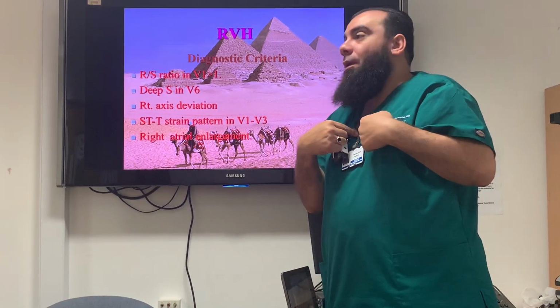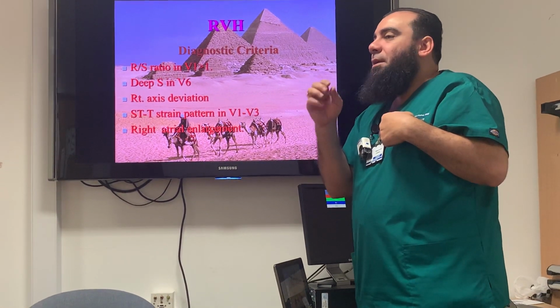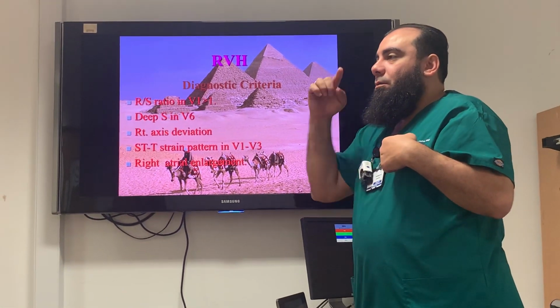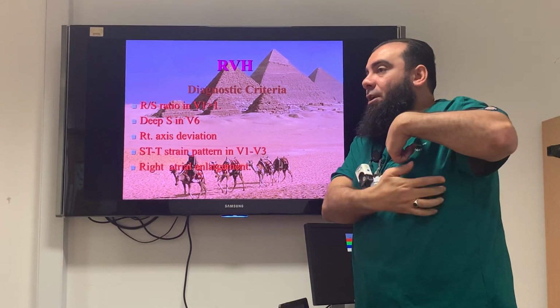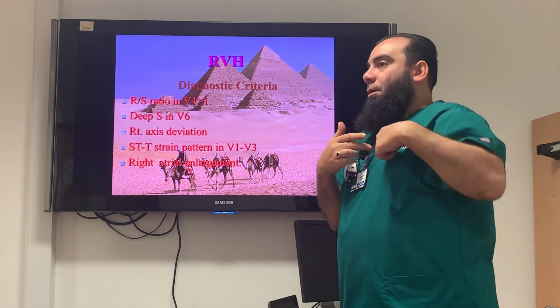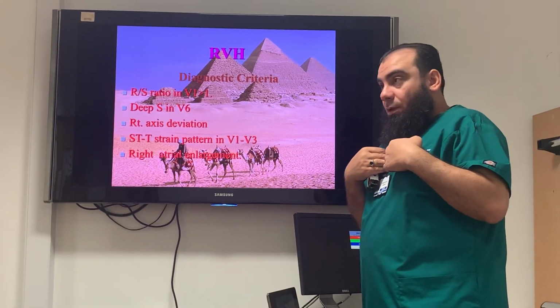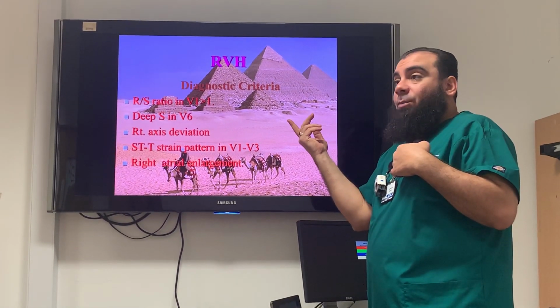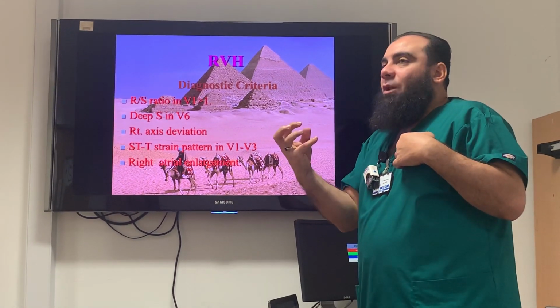Again, what leads look at the right ventricle? V1, V2. Okay. So what actual component of this complex represents the right ventricle? R. Because S is negative. It gives the left ventricular activity, but negative because it is away from the lead. So the only positive here is R, which represents the right ventricle. That's why RSR dash will go to V1 in bundle branch block. So if hypertrophy happened to the right ventricle, what will happen to R?